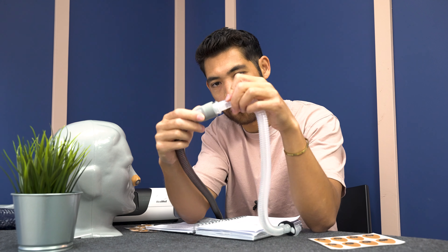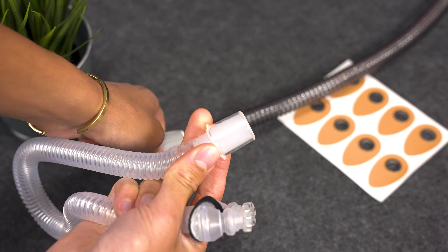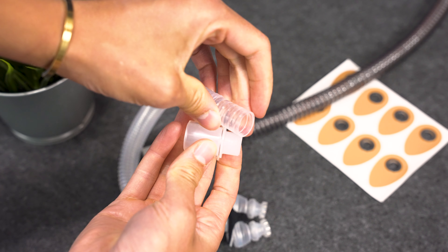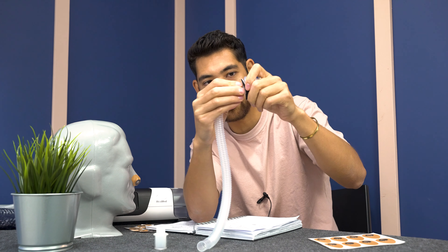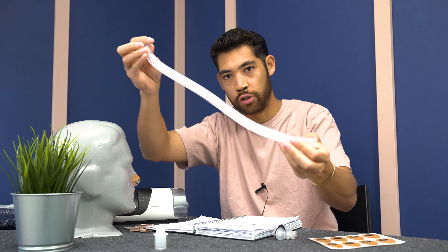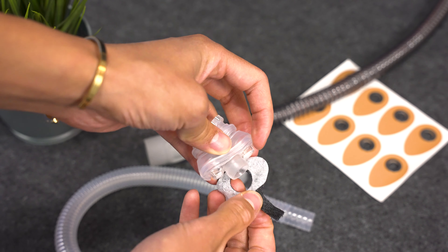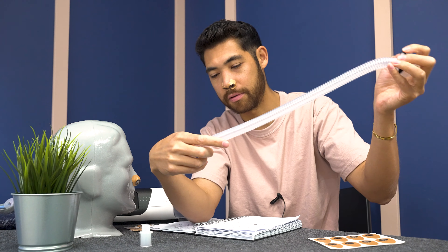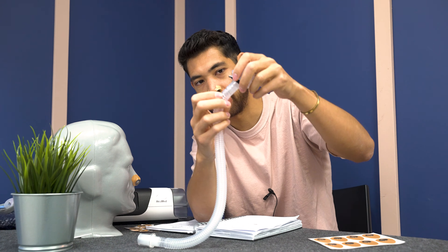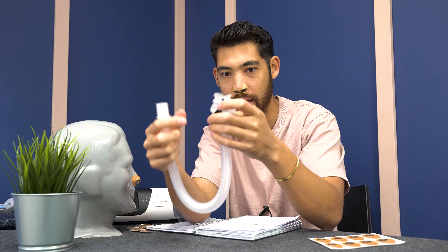Looking at the ergonomics of the mask, we have a 360 swivel right here where the light tube connects to the climate line. We can take this off very easily, and if you want to clean it, they made a way to take this tube off and clean all around here — super easy. Then we have this little tube that also disconnects from the cushion itself, so you have a completely unobstructed tube which you can actually use a tube brush on. The diffuser can also be un-velcroed, taken off, and washed. Nothing over-engineered, no weird swivel ball joints — it just swivels. It's everything you would want in a quick-connect, easy-to-release, swivel tube design.